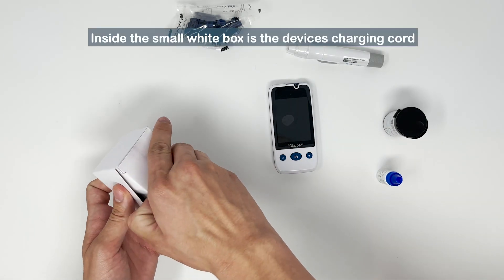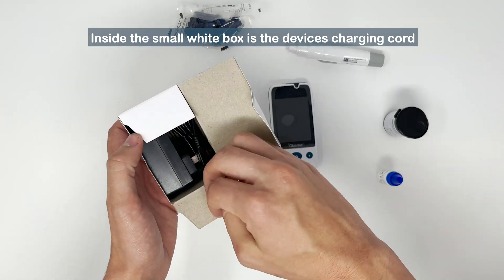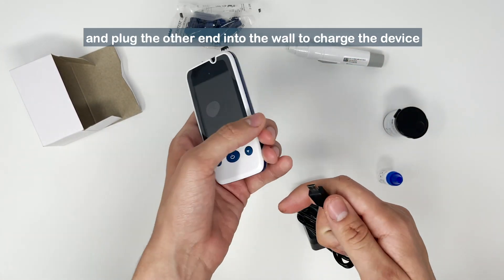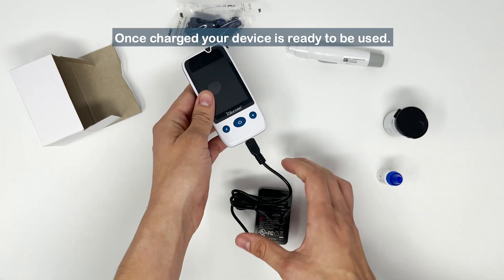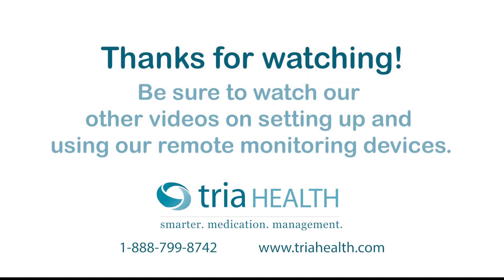Inside the small white box is the device's charging cord. Insert the charging cord into the bottom of the device and plug the other end into the wall to charge the device. Once charged, your device is ready for use.